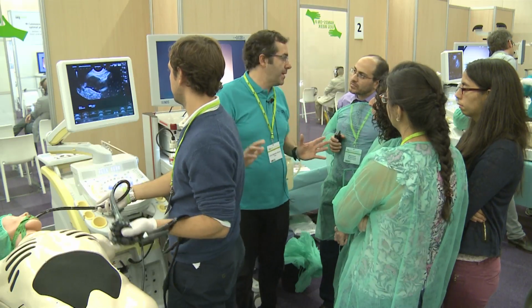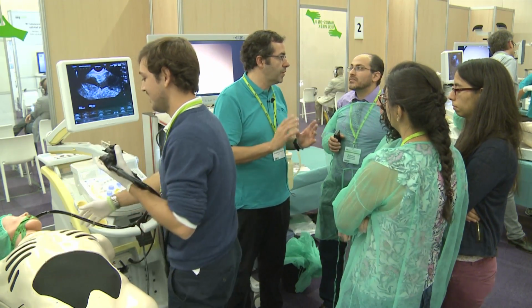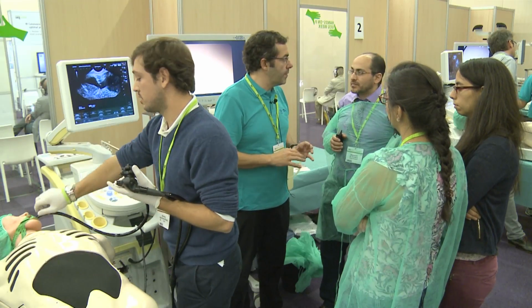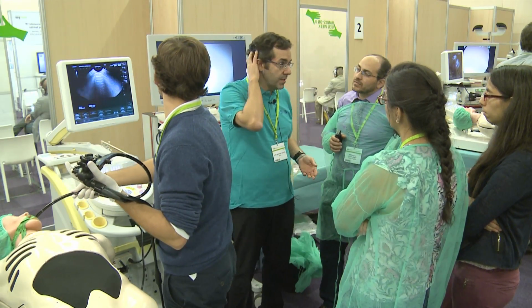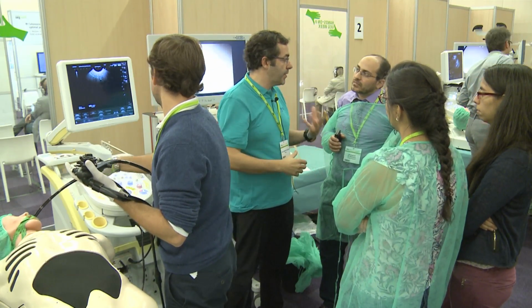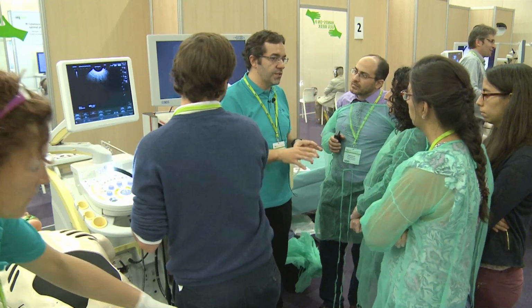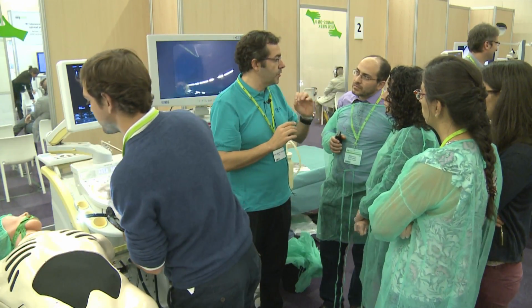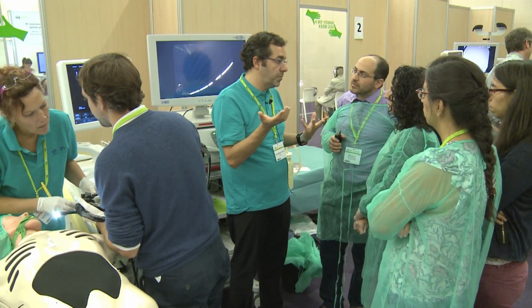If you go for a pancreatic mass and you have a liver lesion, it's better to go for the liver lesion because you are going to confirm an M1 lesion. Okay, but sometimes you need to go for both. The other day we performed a case with a liver mass, lymph nodes and a pancreatic mass, in a patient with a history of colon cancer. So we targeted the liver and also the pancreatic lesion. We didn't go for the nodes because we didn't really care.